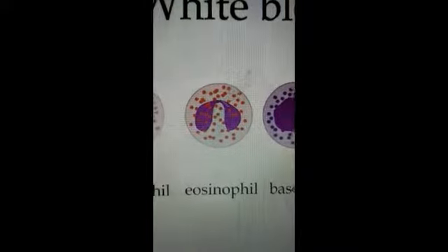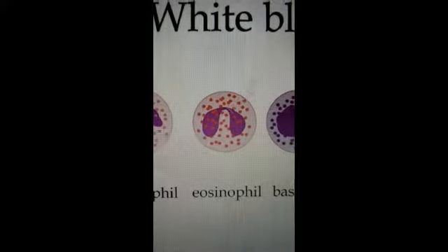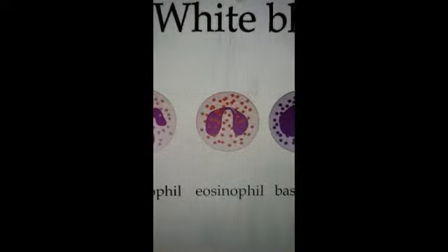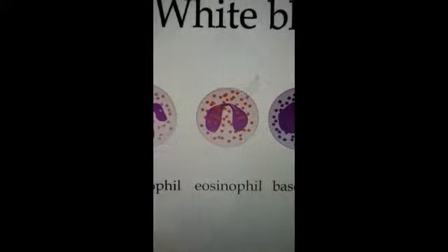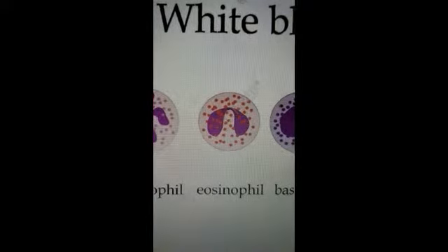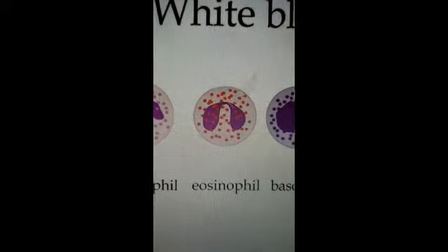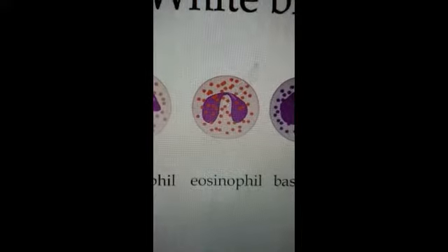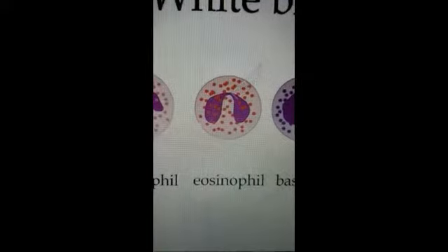Next we have eosinophils. These are kind of similar looking to our band neutrophils, except the edges are a bit rounder and that middle bridge is much thinner. So that's a good way to be able to tell them apart. And when we're seeing elevated levels of eosinophils, it's usually because of an allergic reaction, something that is going to stimulate the immune system. Sometimes you will see it with a parasitic infection. So those would be some of the things that would cause our eosinophil levels to increase.